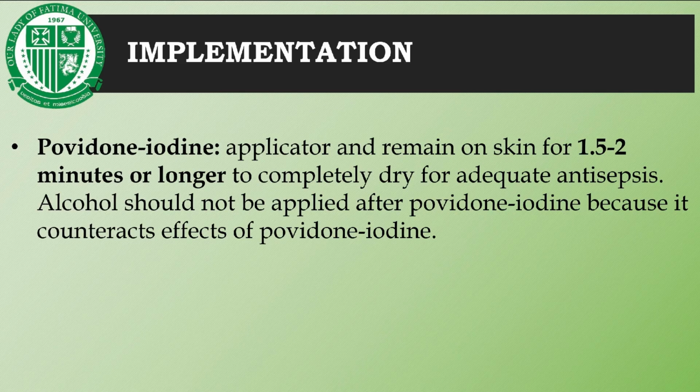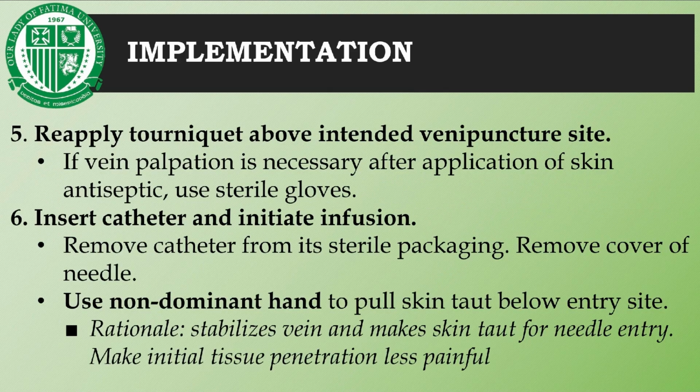Alcohol should not be applied after povidone iodine because it counteracts the effects of povidone iodine. After cleaning the venipuncture site, reapply the tourniquet above the intended site. If vein palpation is necessary after application of skin antiseptic, use sterile gloves.